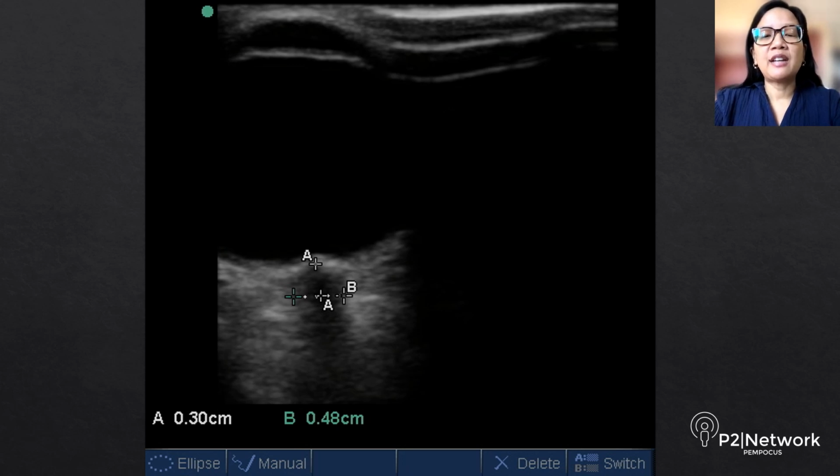And in this 11-year-old child, a diameter of 4.8 millimeters is elevated. Again, remember the cutoff is 4.5 millimeters in this age group. And so this was concerning for elevated optic nerve sheath diameter. Based on this, we expedited the patient's workup, which at our institution included a rapid MRI. He had labs and neurosurgery was consulted.